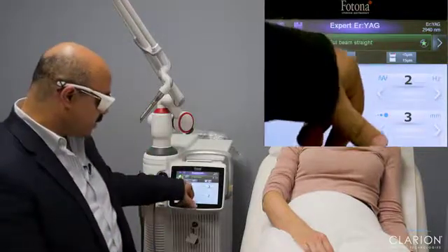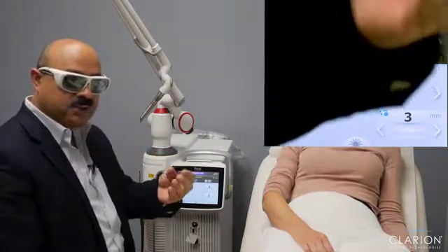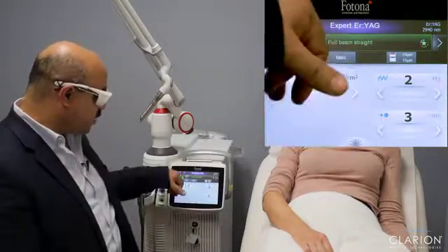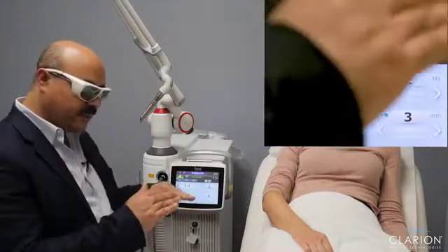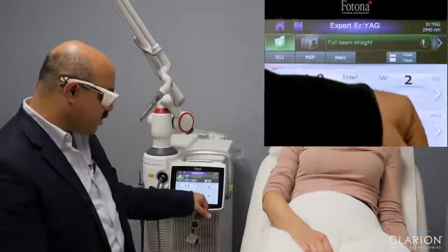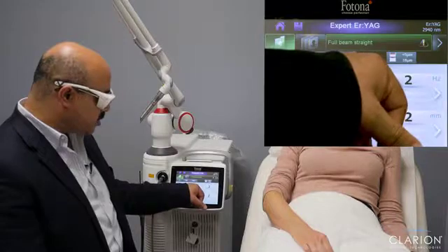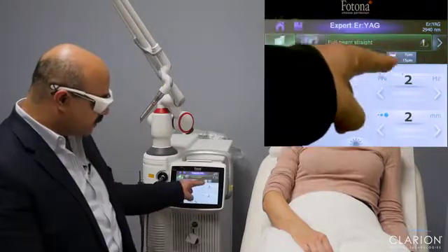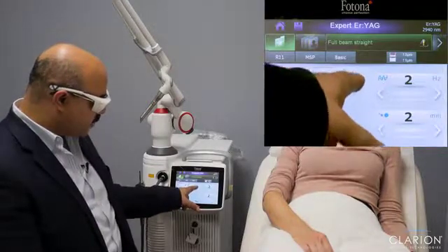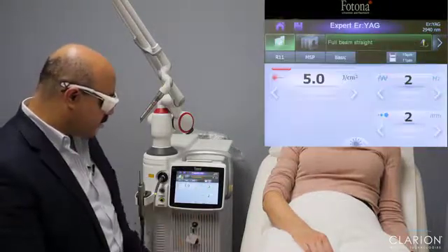We are using the short pulse, so the micro short pulse is the shortest pulse duration, which ensures that the effect is going to be mainly ablation and very minimal coagulation. So the MSP is used. We are using the R11 handpiece, which is the full field resurfacing, and then we are going to be using the small spot size, 2 mm spot, and we increase the fluence in order to see about 15 microns of ablation. So we can see here that the ablation and coagulation is shown, so increase the fluence up to 15 microns of ablation. So now it's 15 microns ablation and only 11 microns of coagulation.